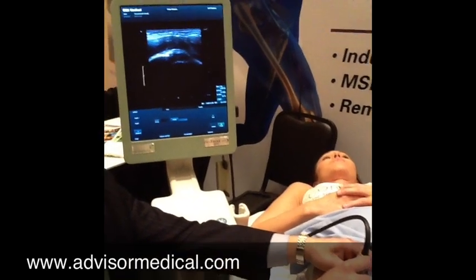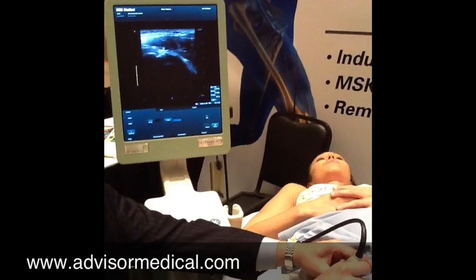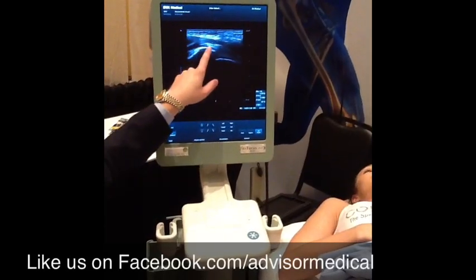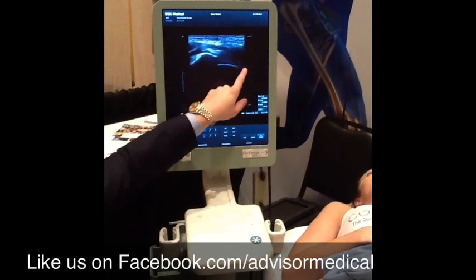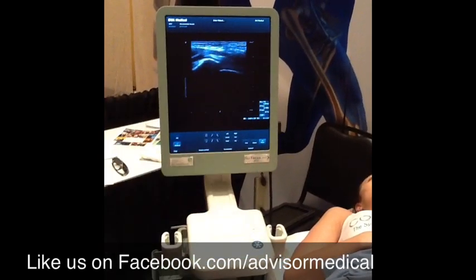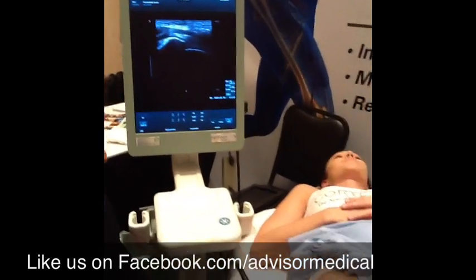As I rotate, you're going to see it elongate. Now I'm going to point out a couple structures to you. This is the acetabulum, this is the femoral head, and this is the ligament coming over top of it. Now because the injection wants to go between the neck and the head, we need to scan it out.